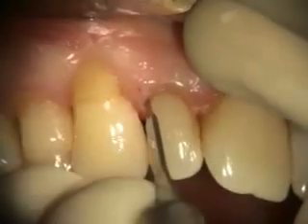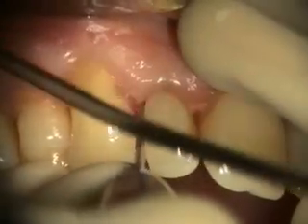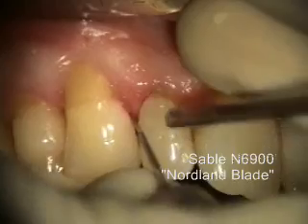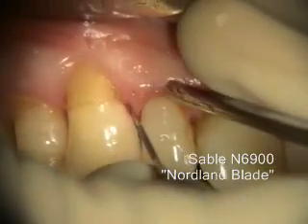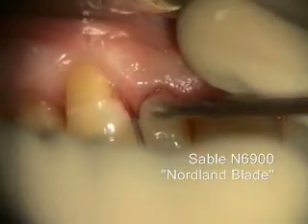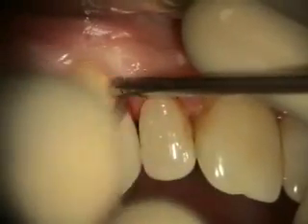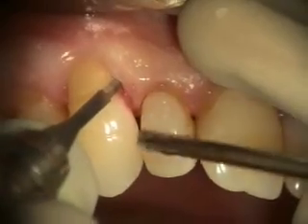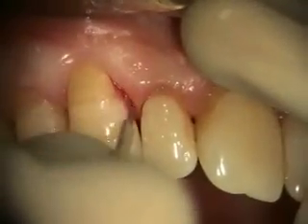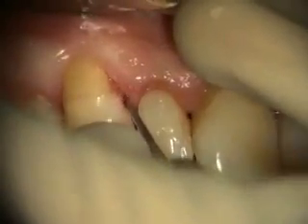We're using this Sable micro — it's called an N6900. It's a little bit smaller than the micro mini, which is another blade that they have. This one was designed by Peter Nordland, a guy in La Jolla. I used to use these all the time for connected flap mobilizations, but then I started doing my modification of the Pat Allen technique.